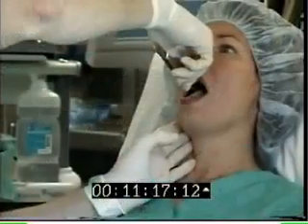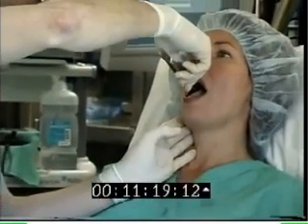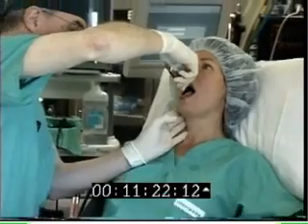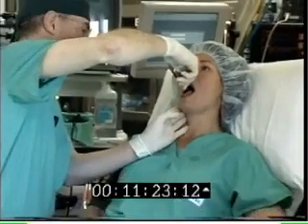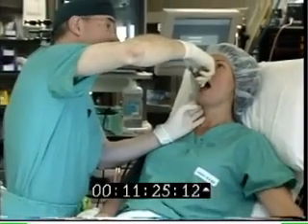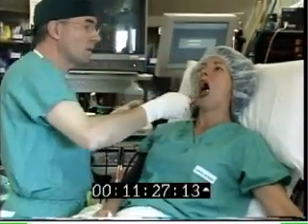The tip of the forceps is placed at each piriform fossa for approximately 60 seconds. This will provide an intense block of the superior laryngeal nerve.